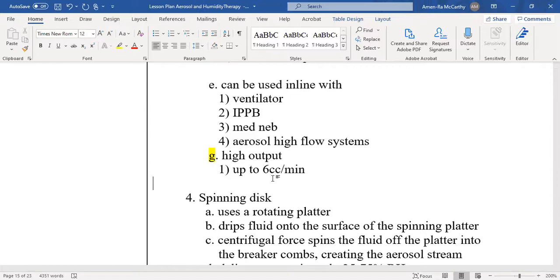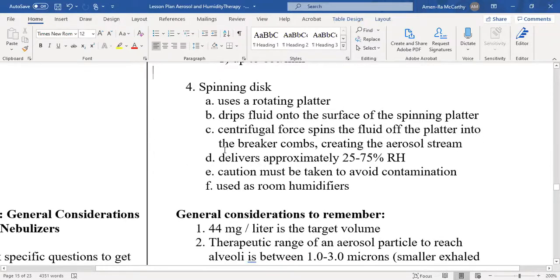But you gotta get the sputum sample first, so this is how you get it, right? You don't want them to just spit some spit in there. I want sputum. I want a good mixture. Cough that stuff up, a hoggy loogie, right? That's what we want, so that we can find out what you really have, okay? So it's used to induce what? Sputum. All right.